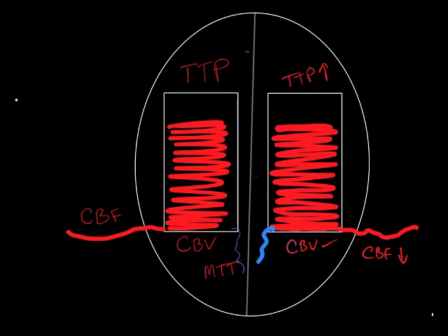And if we follow that red blood cell through, we would see that that red blood cell hangs around for a long time as it makes its way through the tissue, being fed by collaterals to exit. Mean transit time is high. So tissue that matches these parameters are viable but have reduced flow. So this represents potentially salvageable tissue.